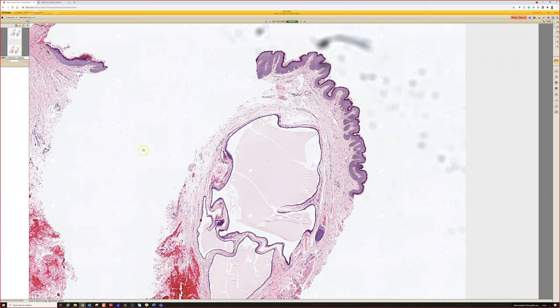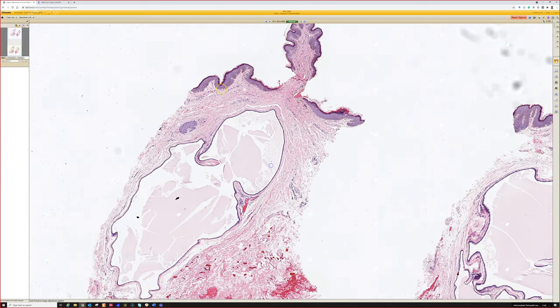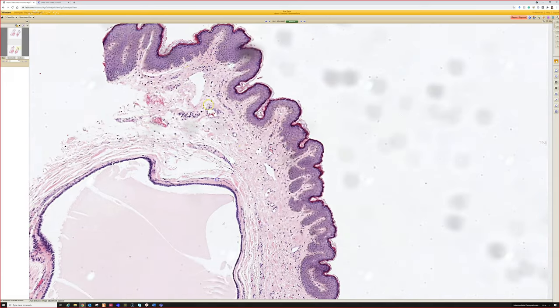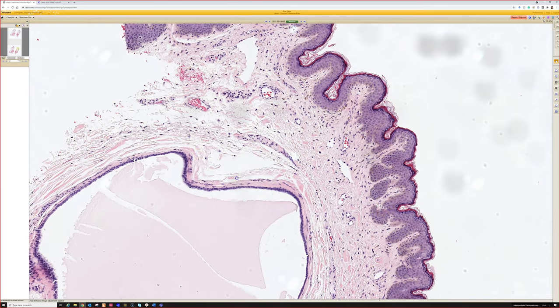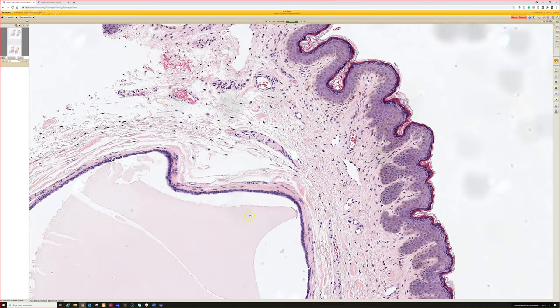Yeah, Hidrocystoma. And this is really nice to see one completely punched out intact. We rarely get to see that because a lot of times they'll get shaved. And an important point for practice is that oftentimes I'll see a shave and they'll want a bump near the eyelid or upper cheek. And then I won't see anything. And then I cut deeper levels. And then down at the base, I see just a little sliver of this. Like I'll just see a little layer right at the base of the shave with a double cuboidal lining.